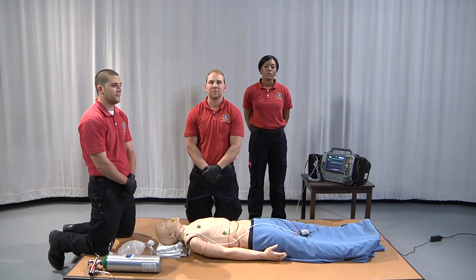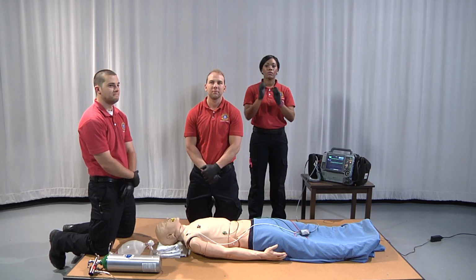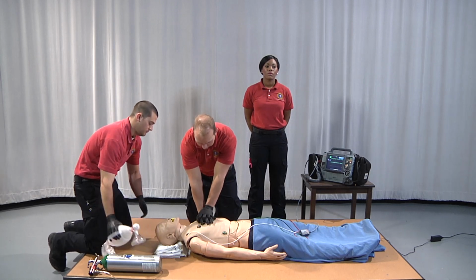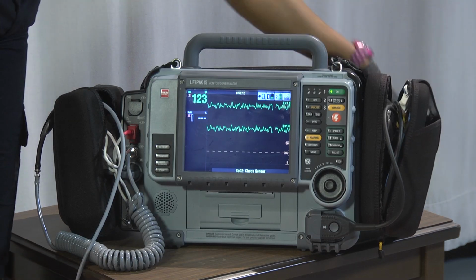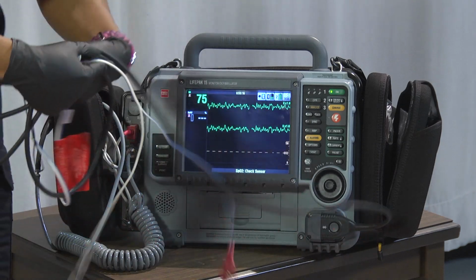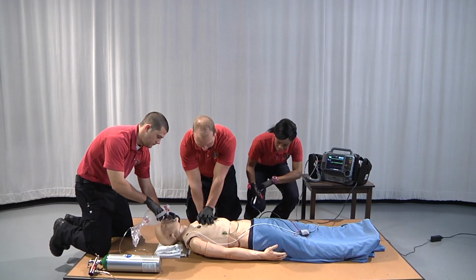We will begin with defibrillation of the cardiac arrest patient. Take appropriate body substance isolation. Ensure high-quality, minimally interrupted CPR is in progress. Apply monitor/defibrillator pads without interrupting CPR. It is recommended that the limb leads always be placed when applying hands-free defibrillation pads.